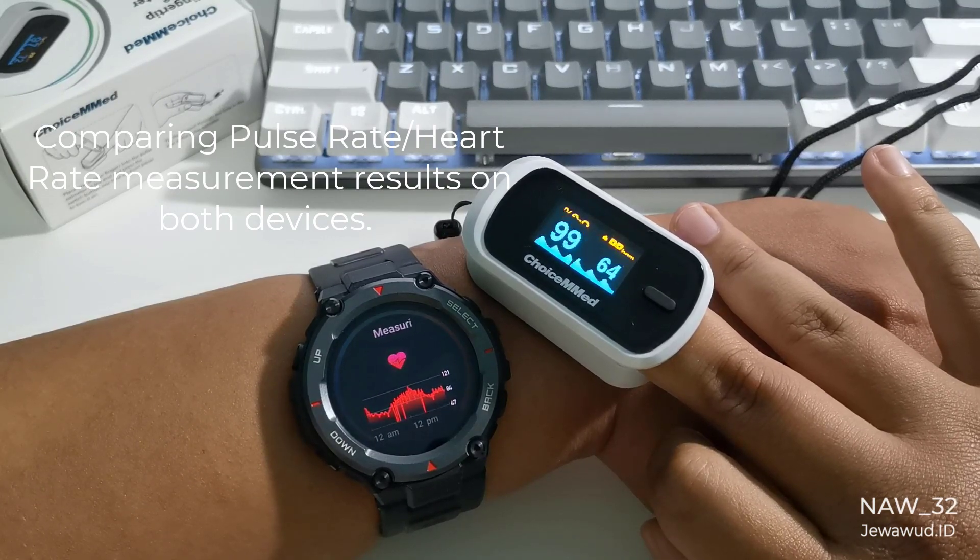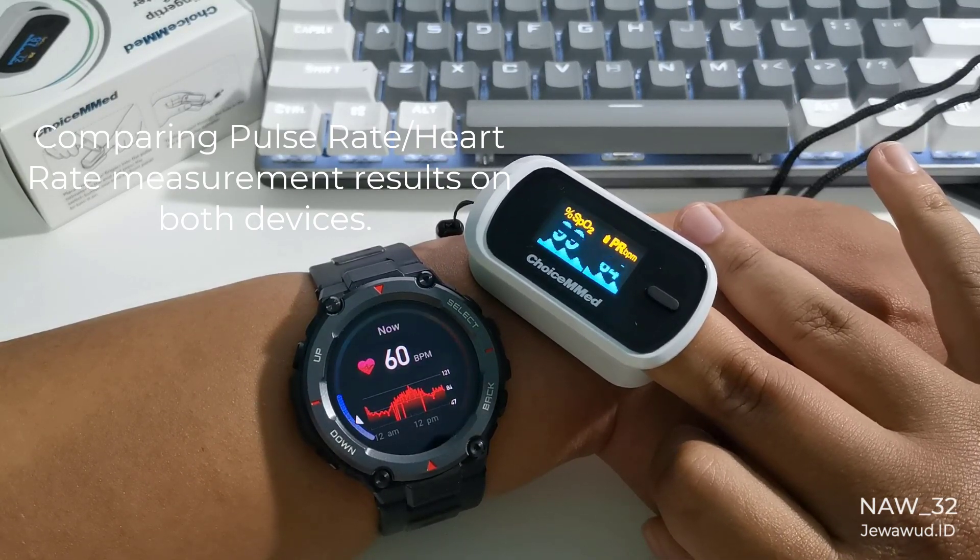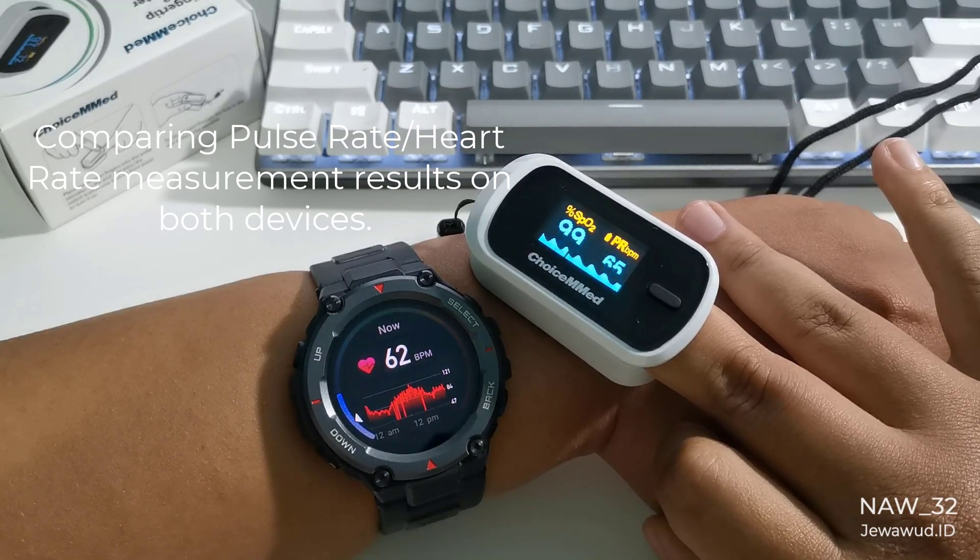Comparing pulse rate heart rate measurement results on both devices — both devices show almost the same number of pulse rate beats per minute.